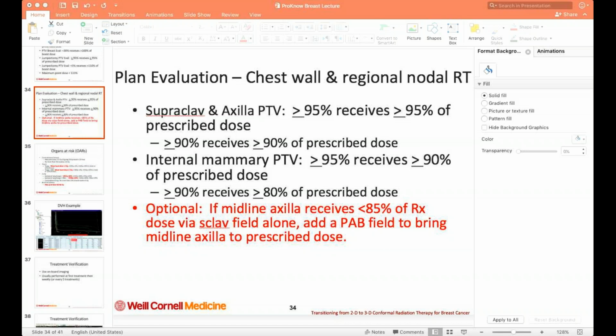One other question was, this is a great question. Does a large volume breast, from Dr. Adeniji Adeoluwa, does a large volume breast or pendulous breast affect the boundaries of the tangential fields, the immobilization device used, or the dose distributions or possible doses to the organ at risk?